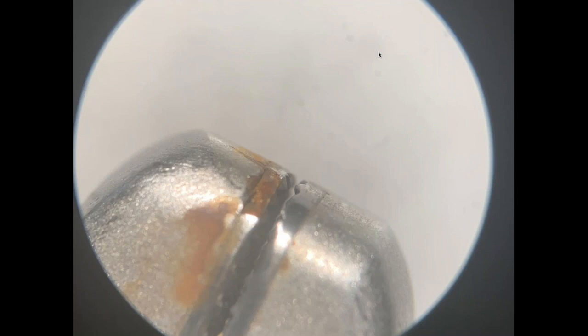Absolutely. This is a close-up of an instrument that was given to us as being rusty. On a first look with the naked eye, there's no way you could have picked it up, you couldn't physically see it, and I've got reasonably good eyes, but a very slight part of the tungsten carbide on this needle holder was chipped away. That had left an unfinished surface, and naturally, when the instrument's being washed, you ended up with free iron being leached and the start of corrosion.